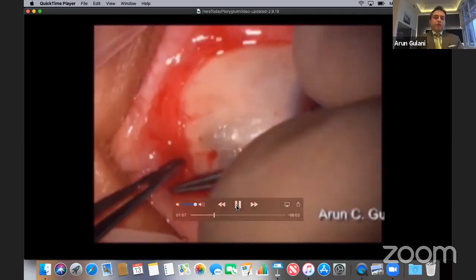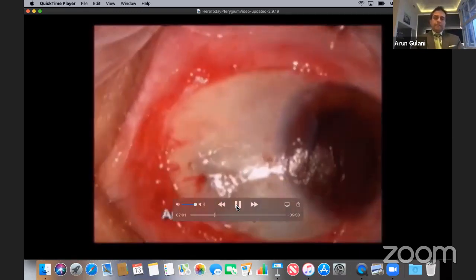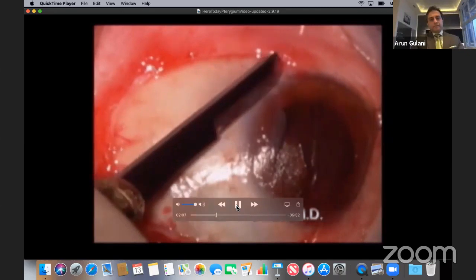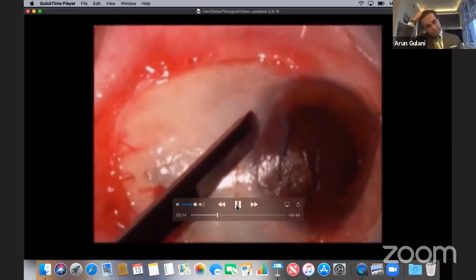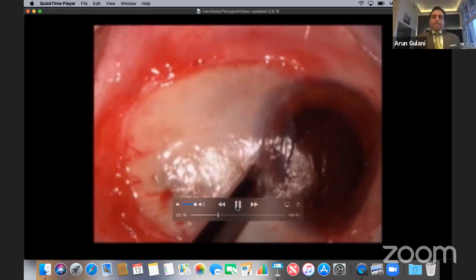Delineating the anatomy is very important. Clearing the medial rectus, very important. Using a blade, I now, using a single sweep movement, cut down the excessive amniotic graft along the limbus in a controlled fashion, deep enough to cut the amniotic graft, but not the cornea.